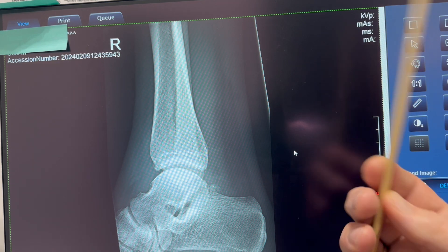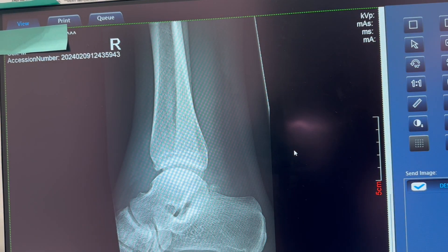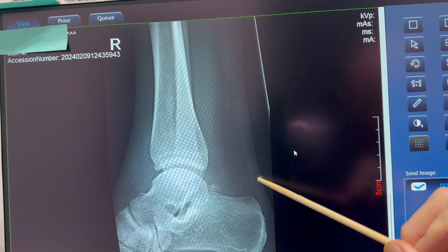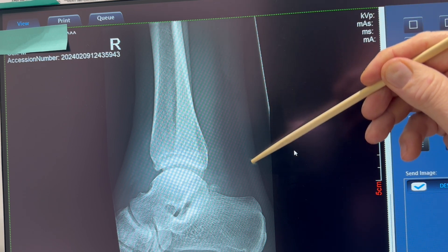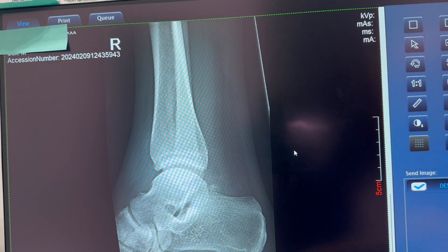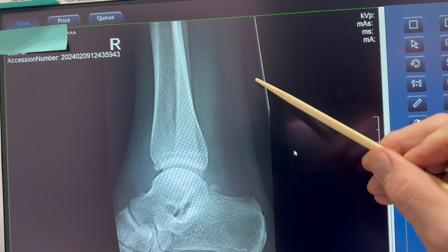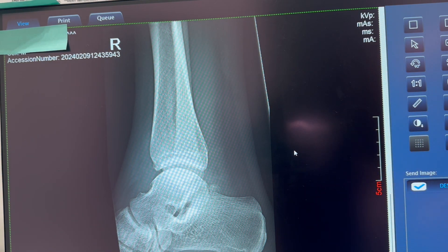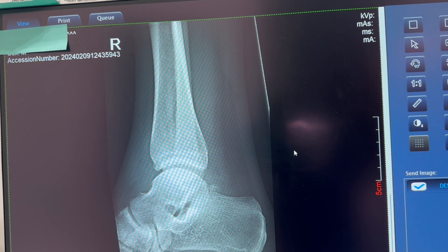Collimation-wise we're good — we've got skin margins on both sides. This is about as tight as I would collimate for a lateral ankle. We want to be able to see the Achilles tendon coming up right here — you can see it attaches to the posterior calcaneus and goes up the posterior distal end of the lower leg. If you keep an eye on that, you can actually see an Achilles tendon rupture on an x-ray, which is kind of cool. This one is not ruptured; it's really patent and really nice.